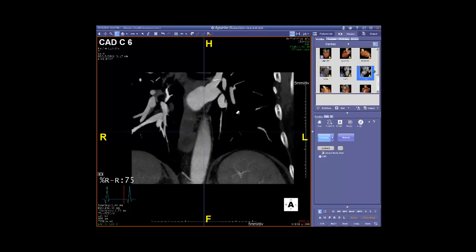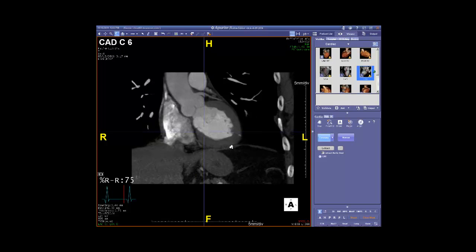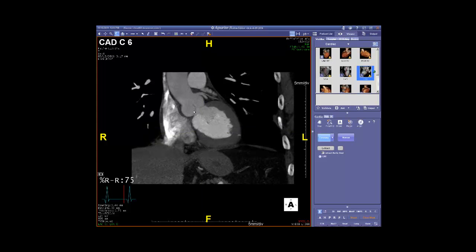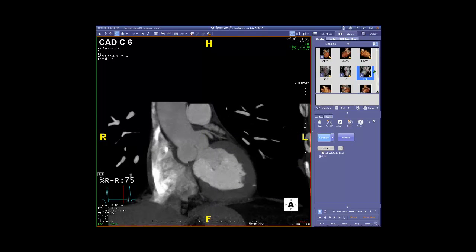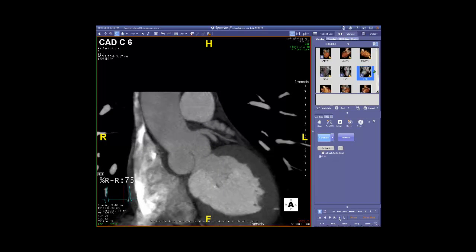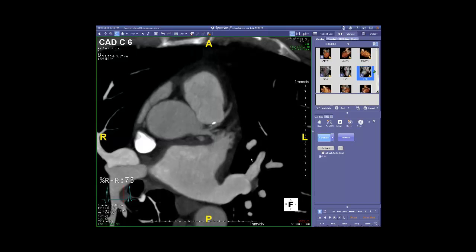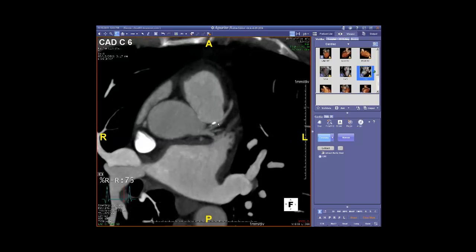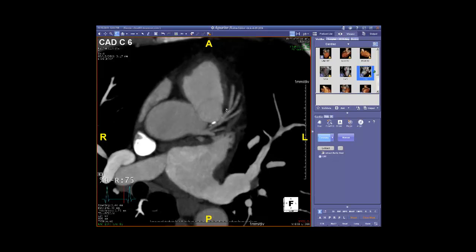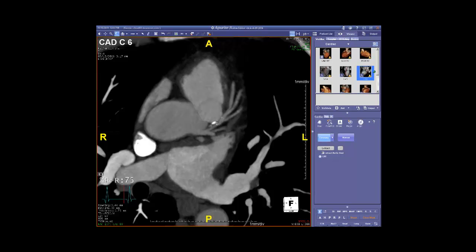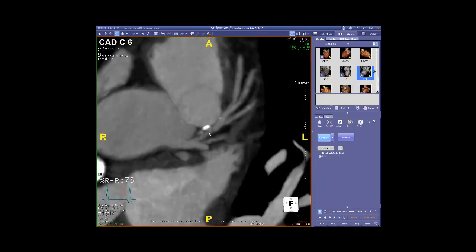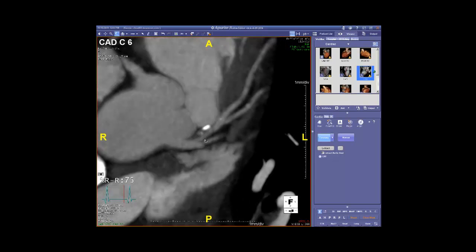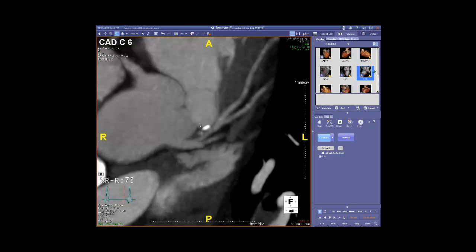Let's move forward and start looking at the coronary arteries. In this anterior view of the chest, we can bring the heart into view. Here we've got the left ventricle, the aortic valve in the closed position, and now we can see the very beginning of the coronary tree. Where the arrow is, is the left main. Zooming in, the left main looks relatively free of significant disease. Moving to an axial or foot view, we can see the left main extending into some branch vessels. The first branch vessel is the left anterior descending artery, and we can immediately appreciate the presence of some disease here — there's some calcified plaque in the proximal LAD. We can also see the presence of some lower-density non-calcified plaque.